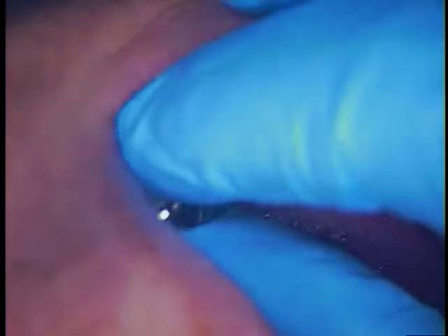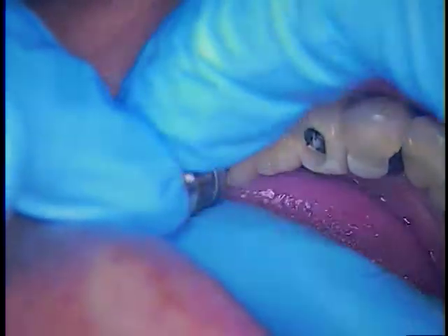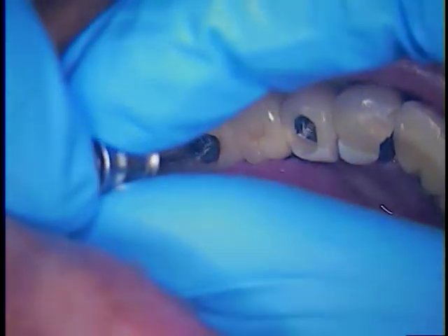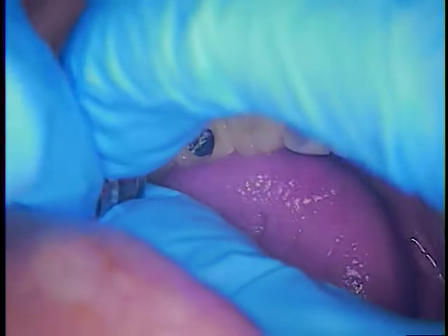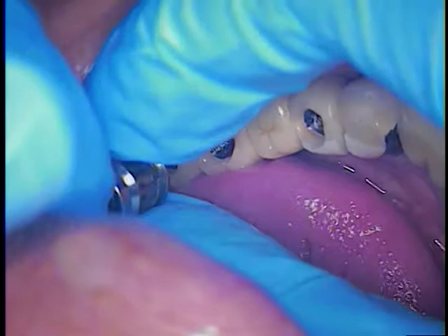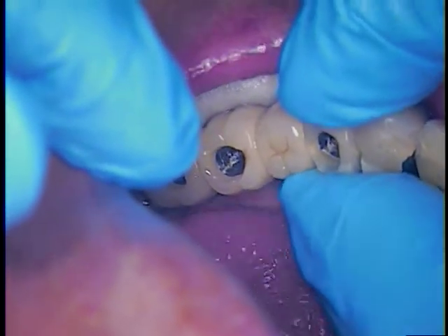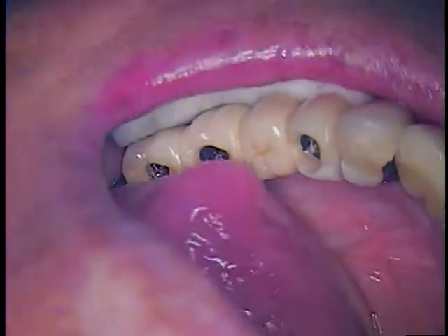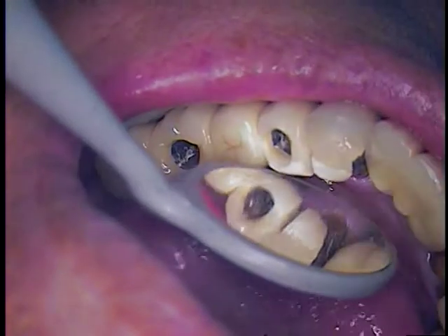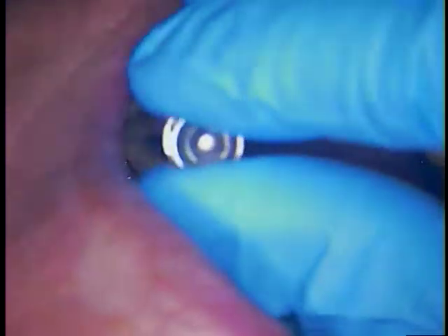Otherwise it's another day here, folks. These are square screws. I took that one — you can feel the bridge lifting as I do it. My question is, is this one coming up? And it's not. See how it tightened up real fast? That's because this front one has the screw stretching on it, so we can't do that. We've got to get this front screw looser.